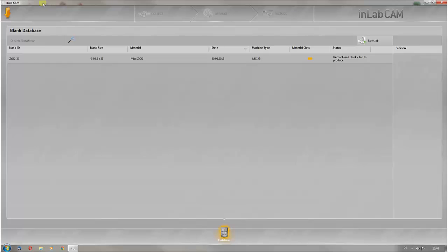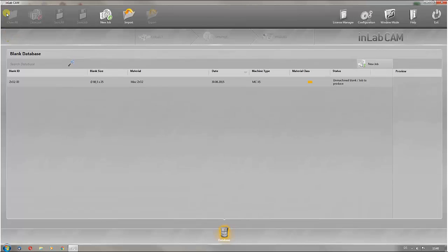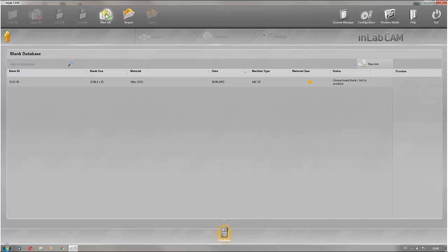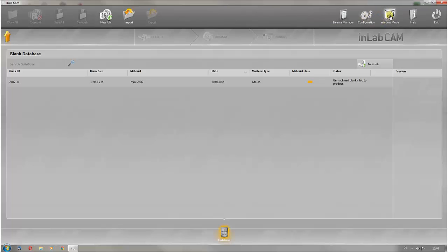Clicking on the orange arrow takes you to the header bar, just as with InLab Software 15. Here you can create, import or export a new job. You can also change to full screen mode here.